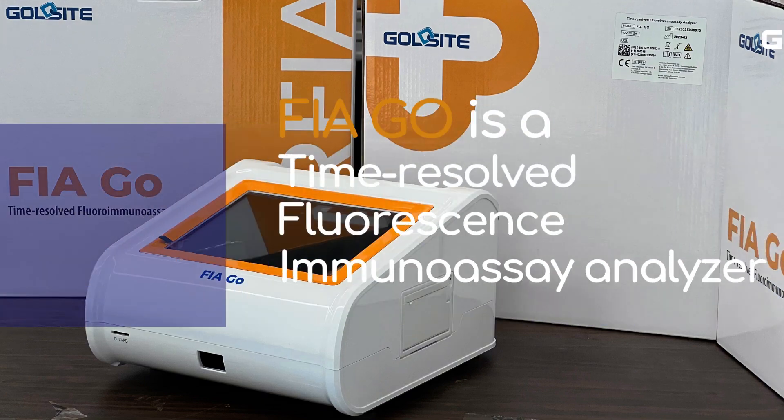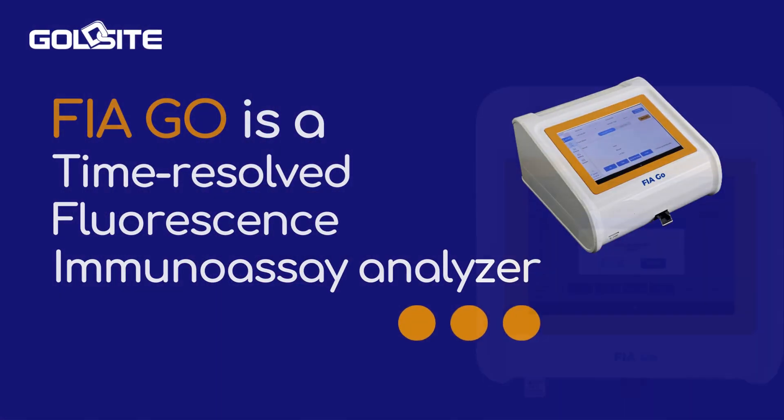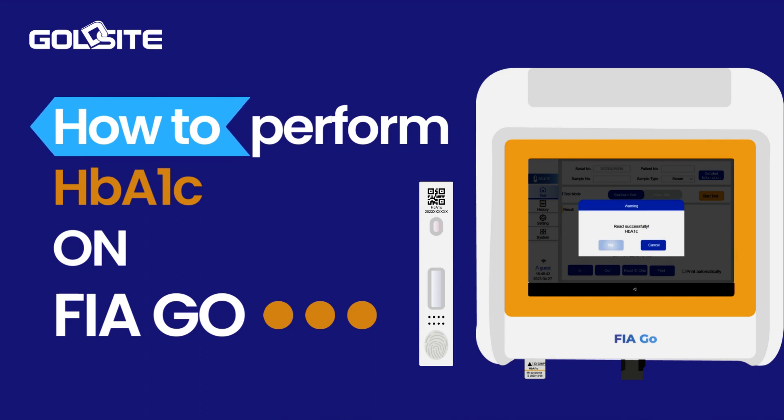FIAGO is a time-resolved fluorescence immunoassay analyzer. This is a tutorial video for the HBA1C assay on FIAGO.